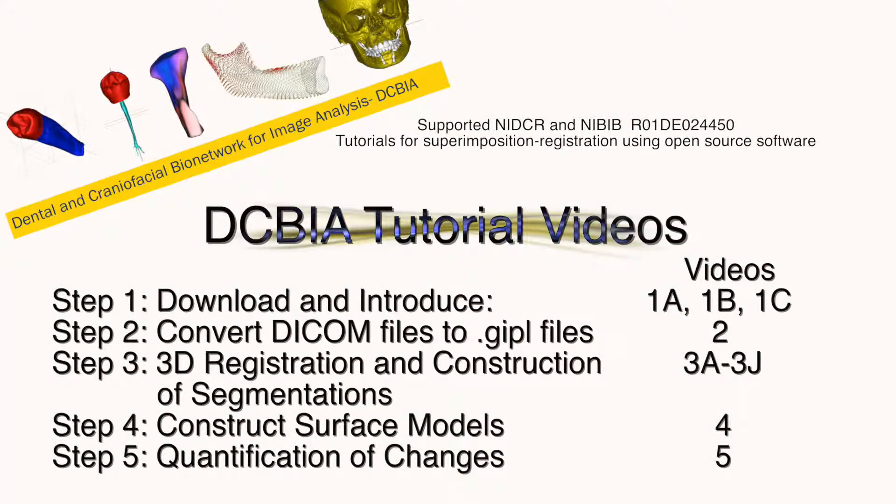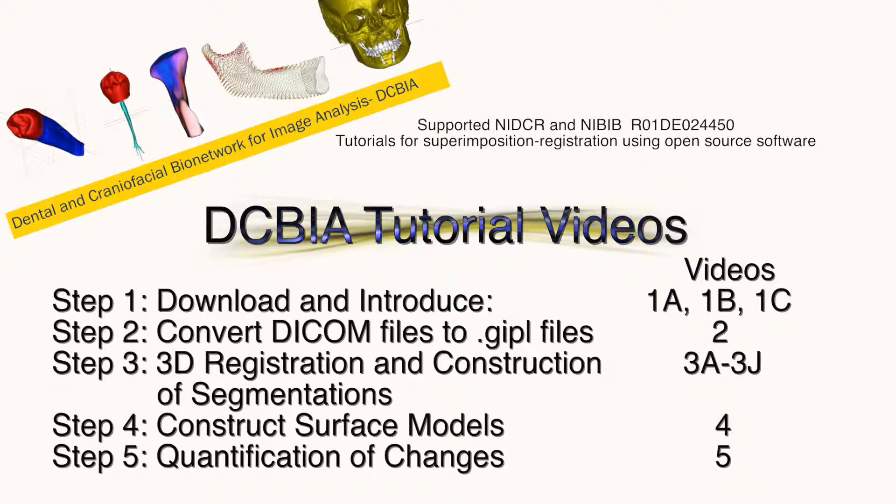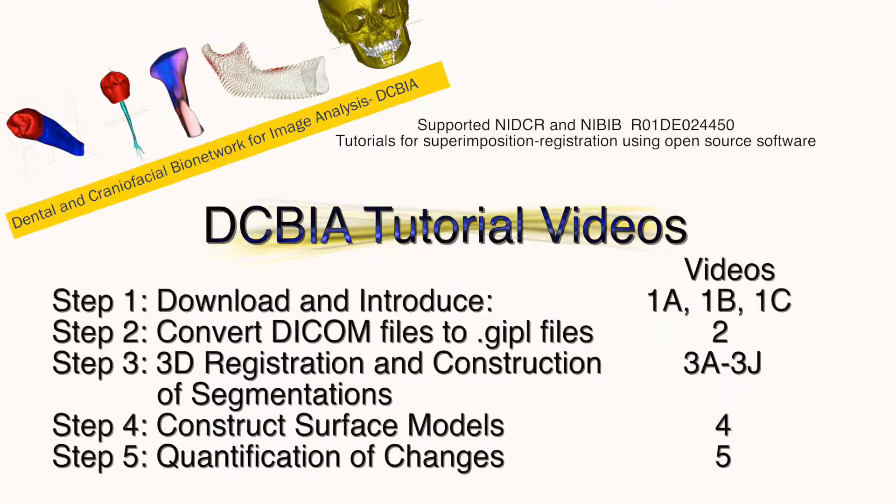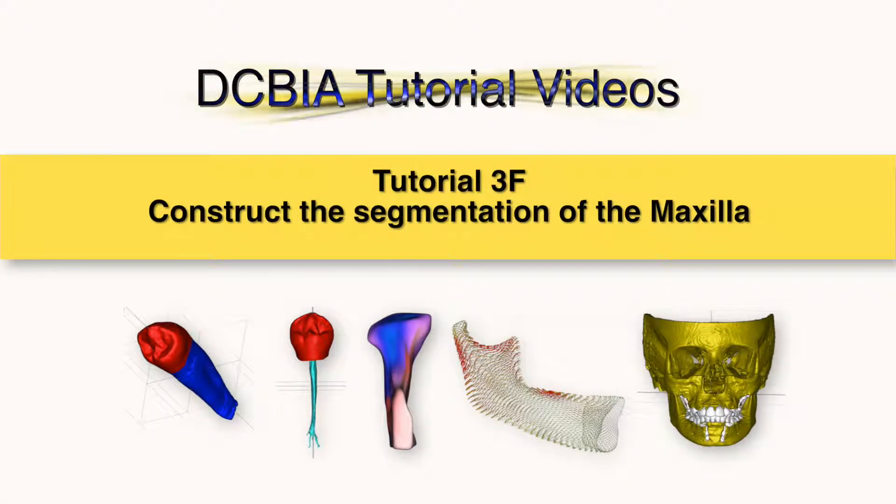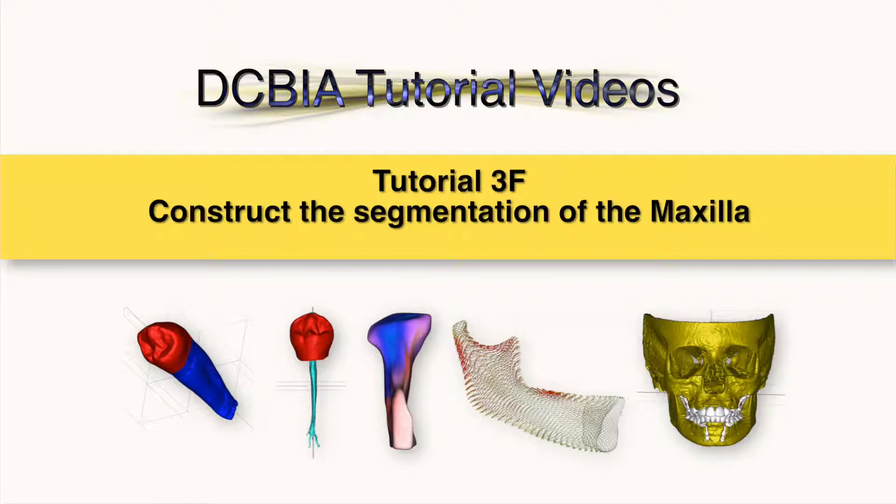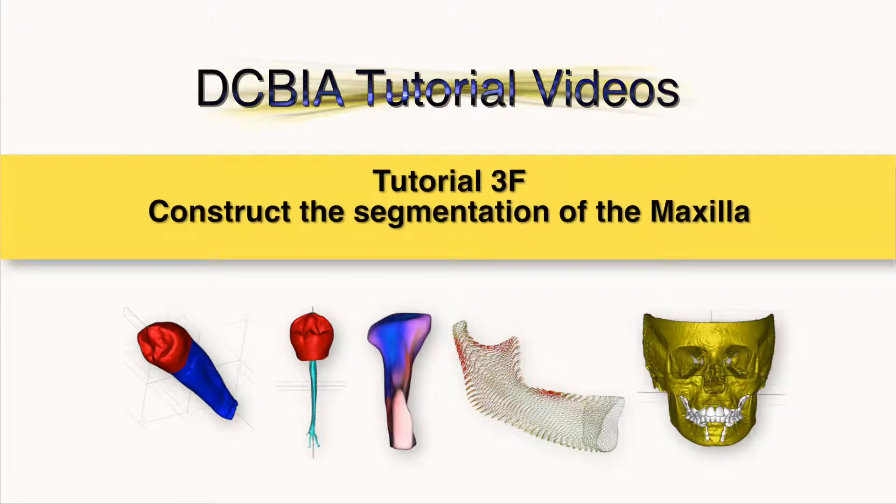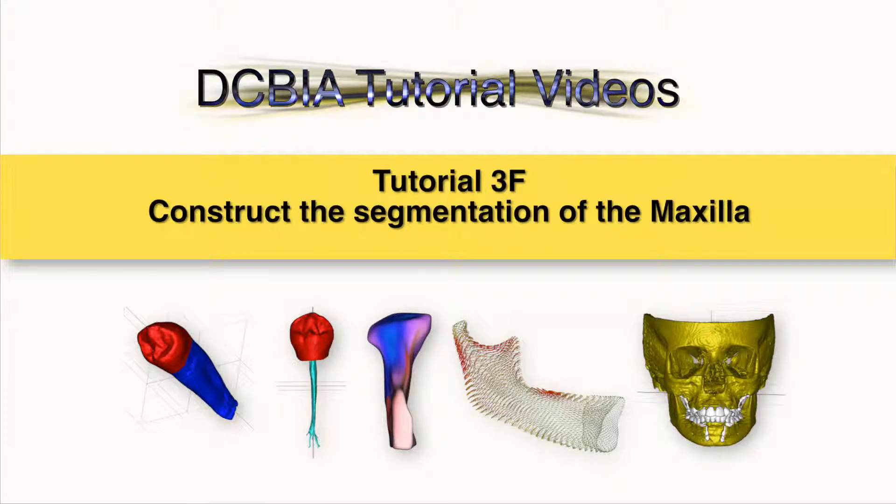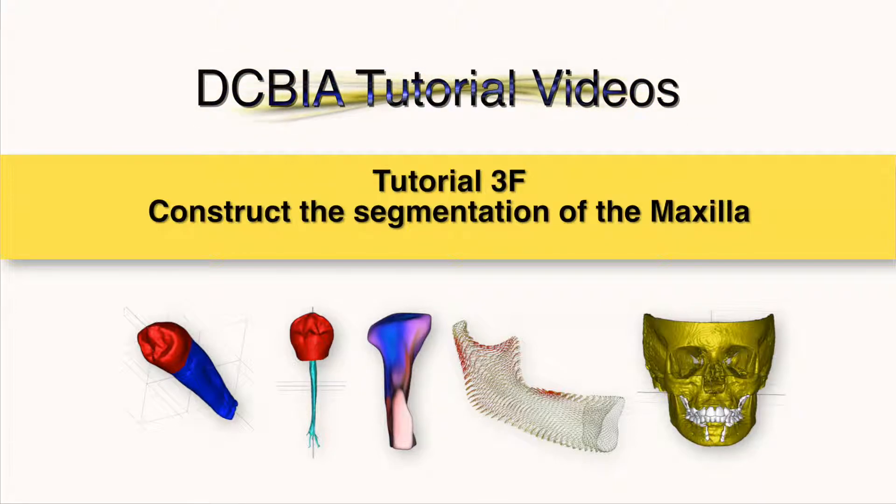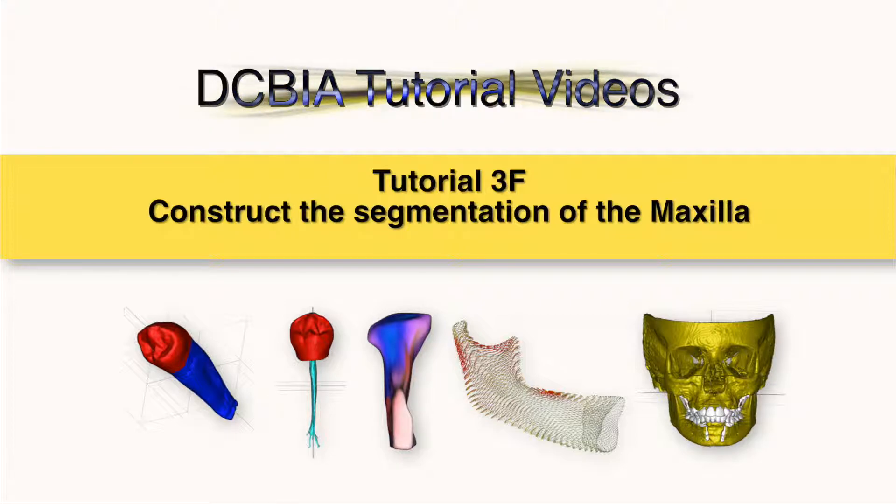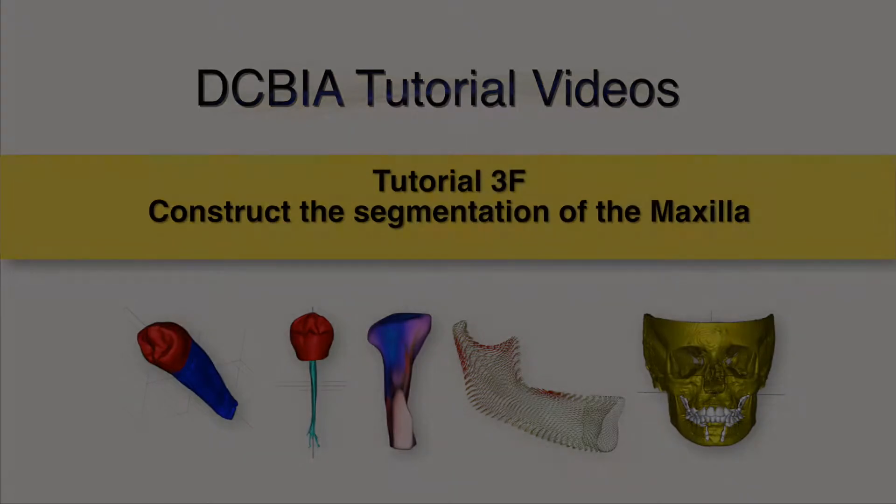This tutorial explains how to construct the maxilla segmentation on ITK-SNAP. The construction of the maxilla segmentation, shown here, can be used as a step after voxel base registration, as displayed here, when scans are already superimposed with the cranial base as a reference. It can also be used as a pre-step for the regional voxel base registration at the maxilla, as shown in tutorial 3C.